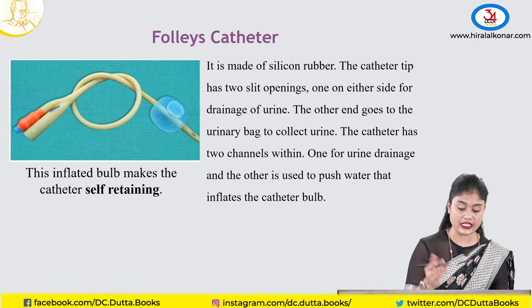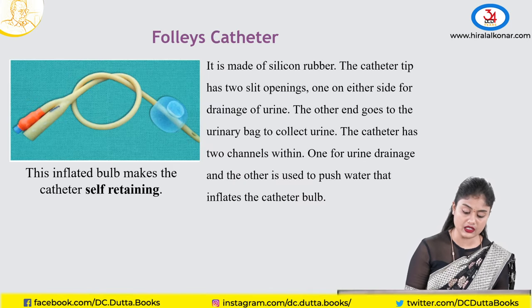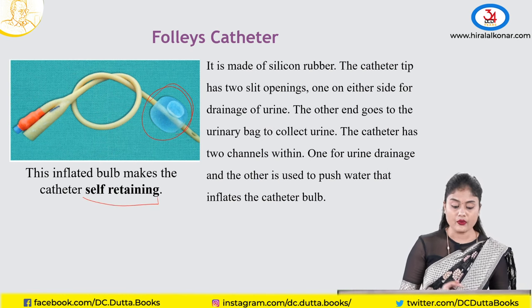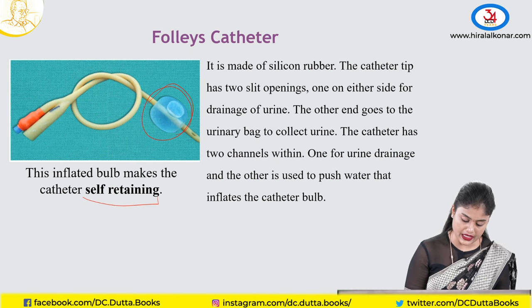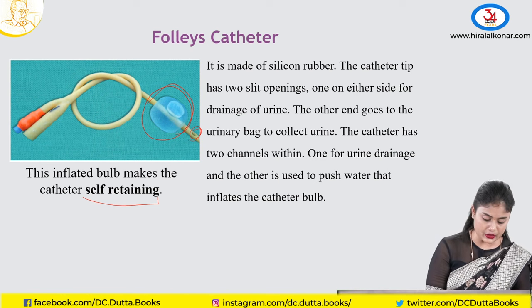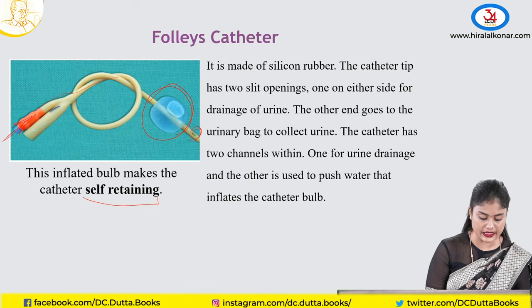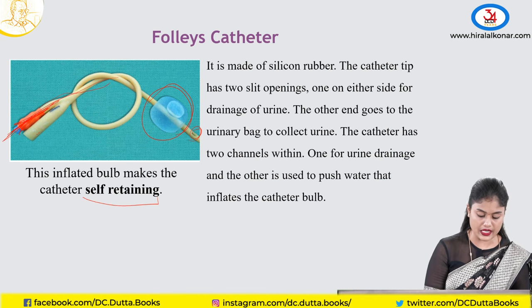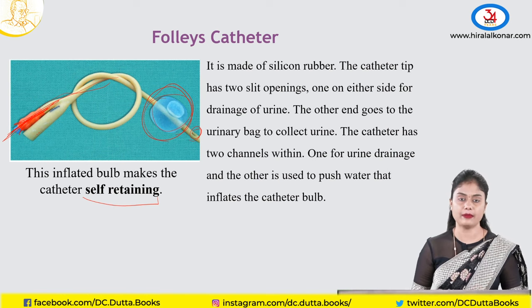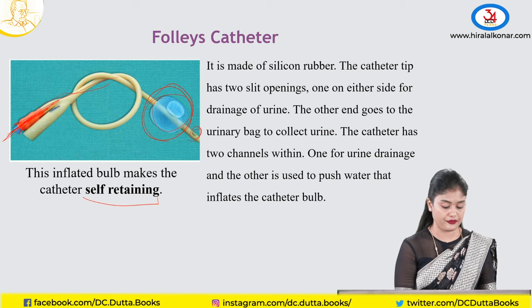Coming to Foley's catheter. As mentioned, Foley's is self-retaining. You can see an inflated bulb on the instrument. Just like the rubber catheter, there is a slit at the tip to drain the bladder. At the other end there are two openings — two channels running through. When you inflate distilled water through one channel, the bulb gets inflated and the Foley's is retained inside the bladder, making it self-retaining.